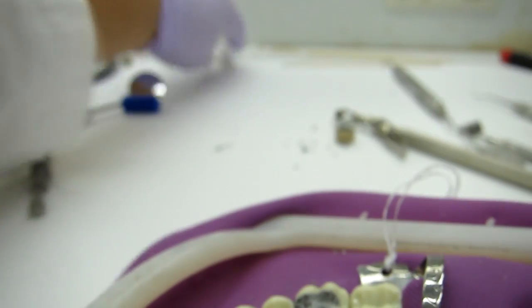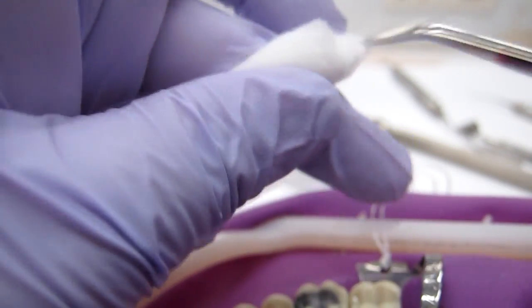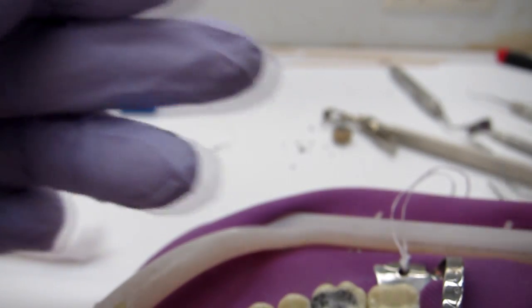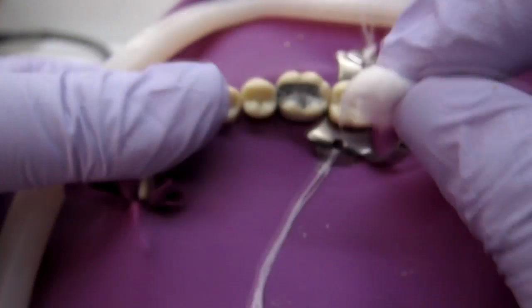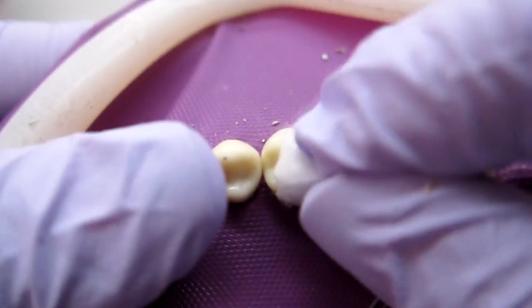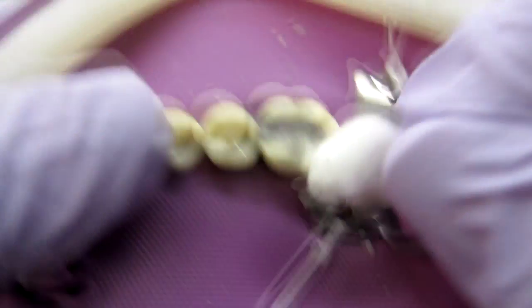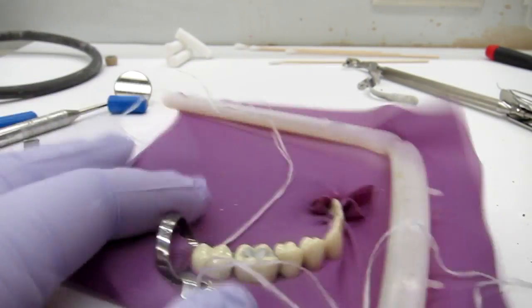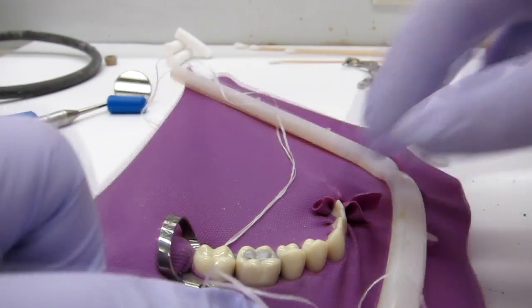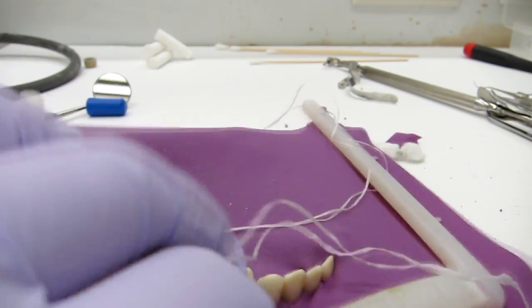At the end I like to take a piece of cotton and get off all the extra dust. I don't like using a brush because if you push too hard it pushes into the amalgam — I just use my fingers with a rubber glove. The last thing you want to do to make sure the prep is good and to get everything out interproximally is to take off the rubber dam.